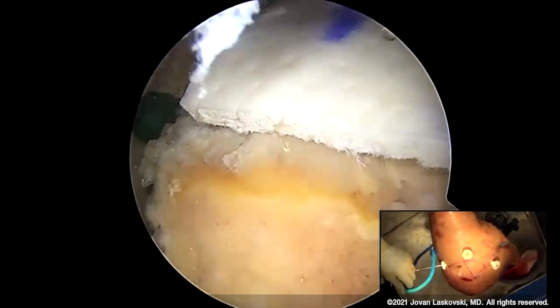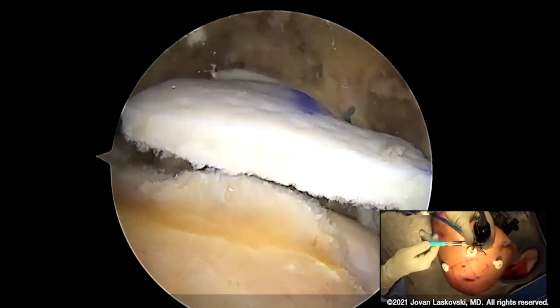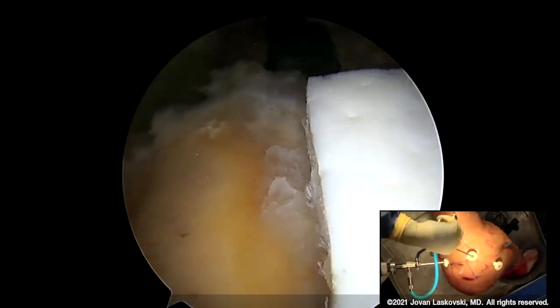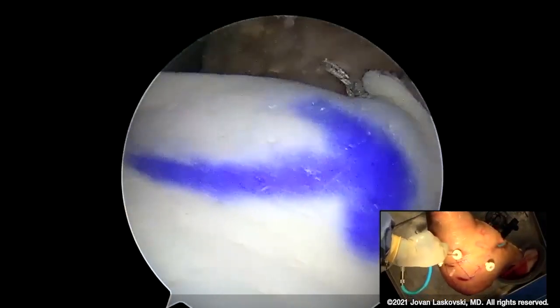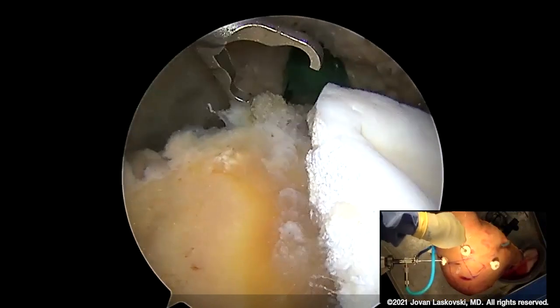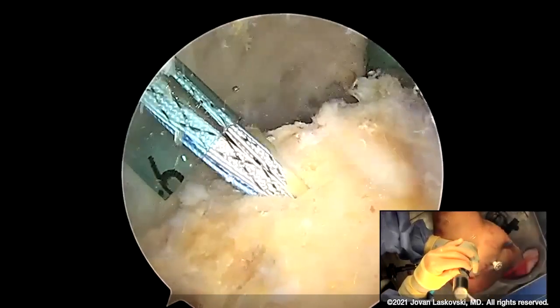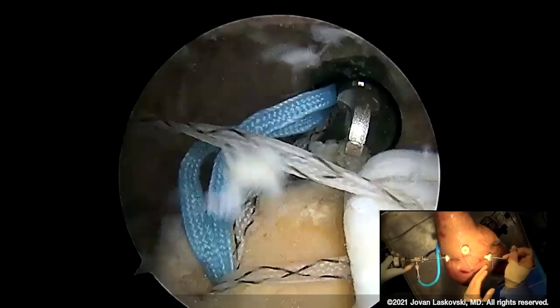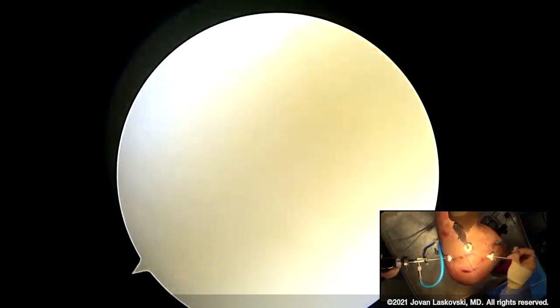You can see our humeral footprint here, and you get the sense of where this is going to lay down on the humerus. We're staring at a rotator cuff tear from the 50-yard line and we've got stability of this graft. We're going to grab the anterior aspect of the graft, pull it into position, and assess the contour — I want this to be under tension with a nice reverse hammock effect. We're going to use a Y-not-RC self-punching anchor, unload your tiger blue, and tie these down as you go, giving you three points of fixation on the SCR graft.